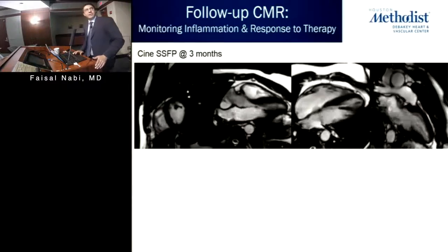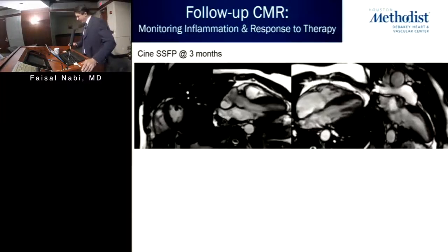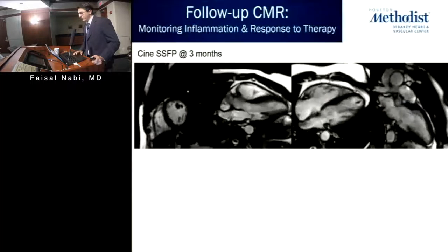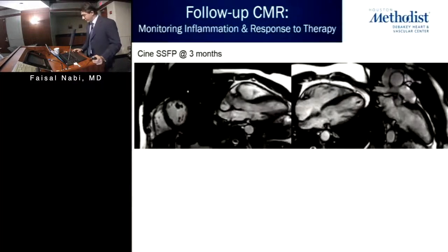Mark my word for it. I know we have limited time here, but I hope you'll see that the pericardial thickness has markedly resolved. There is no further pericardial effusion, and the constrictive physiology that we had noted originally has also completely resolved.